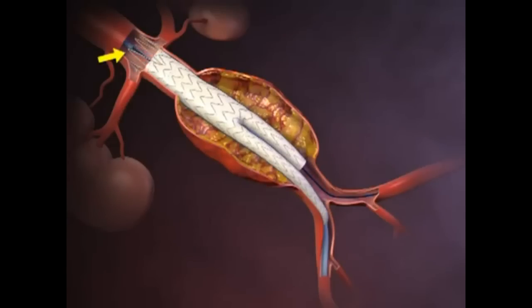The top cap is removed, deploying the suprarenal stent and anchoring the stent graft to the vessel wall.